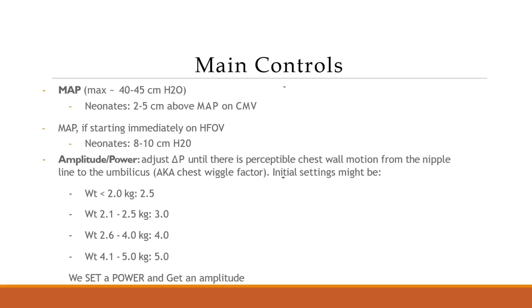It has to be not that you could see it across the room or that you have to put your face right next to it. It has to be that Goldilocks, just perfect wiggle. And this is something that'll take a little while for you to get used to. Okay, but it's just like evaluating chest rise.